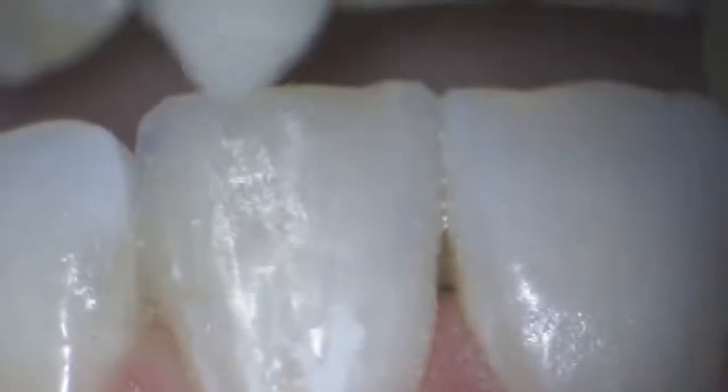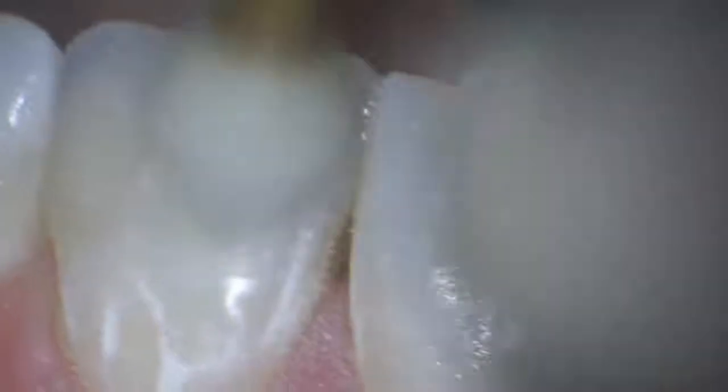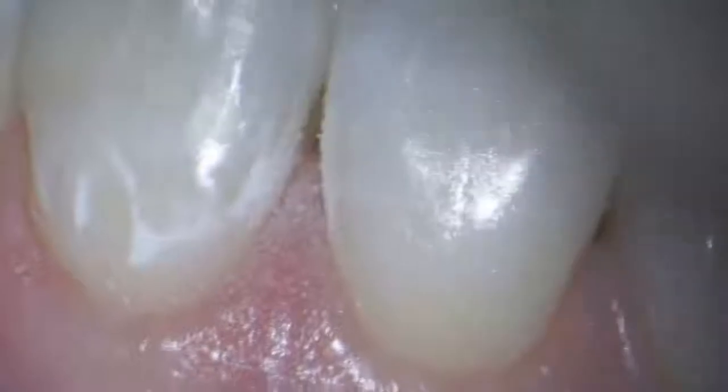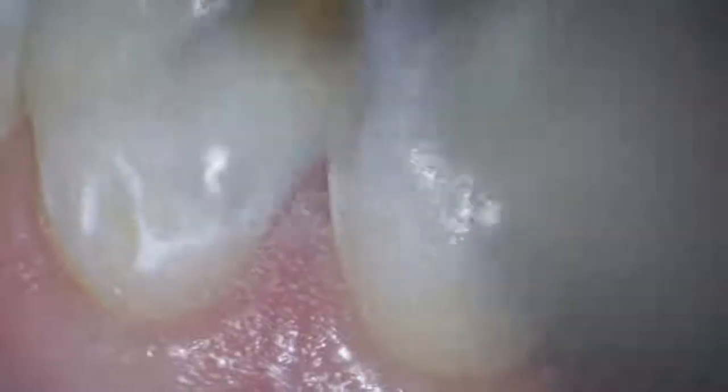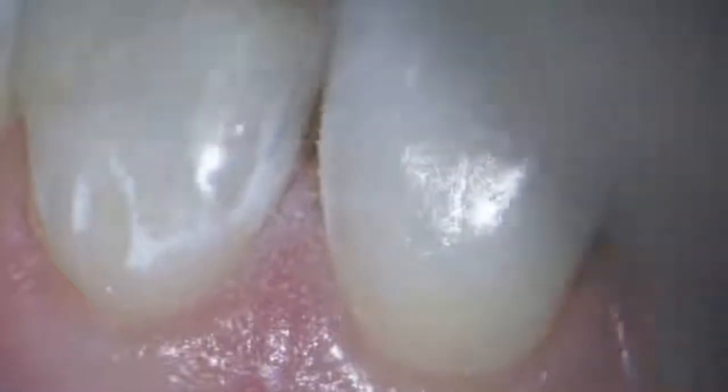At the stage of grinding and polishing, with all the tools that I have, I usually work without water cooling, because this approach gives us the ability to see how the surfaces change under the influence of our rotary tools. This way we can improve the surface quality in a very controllable manner.